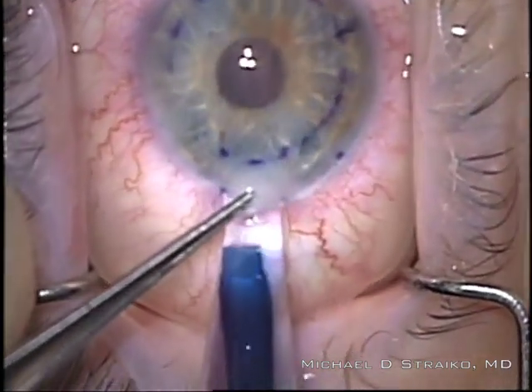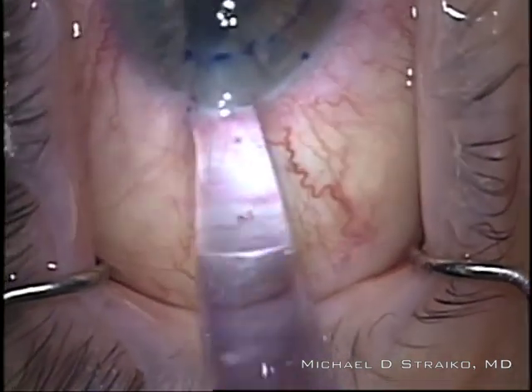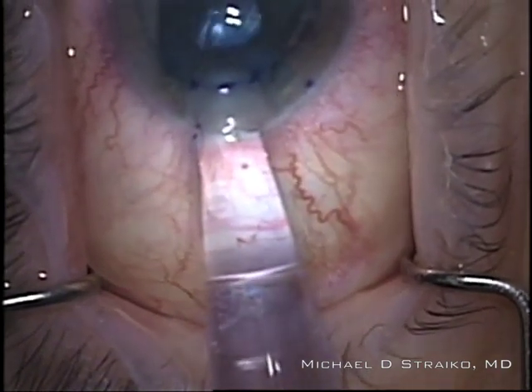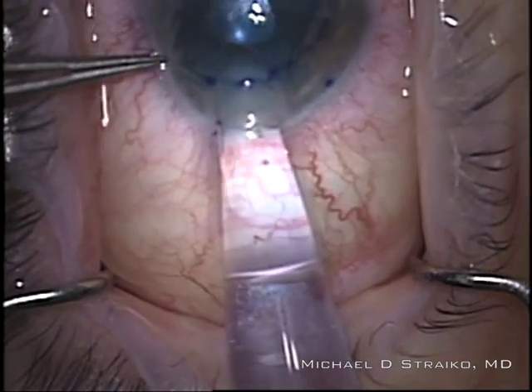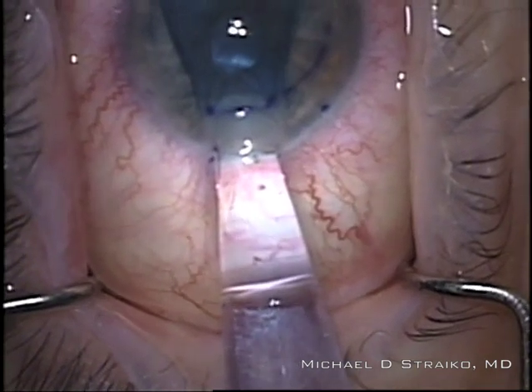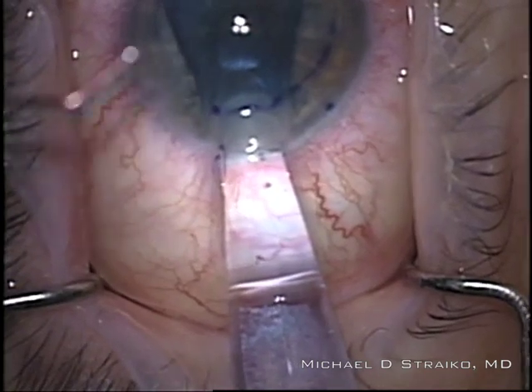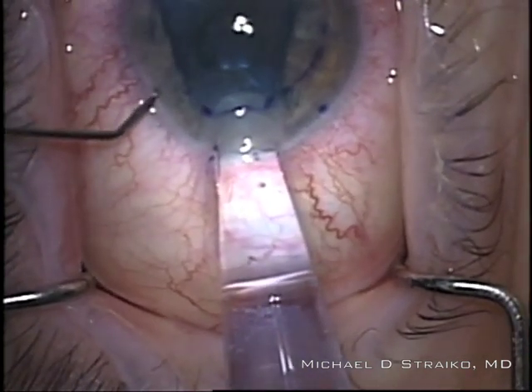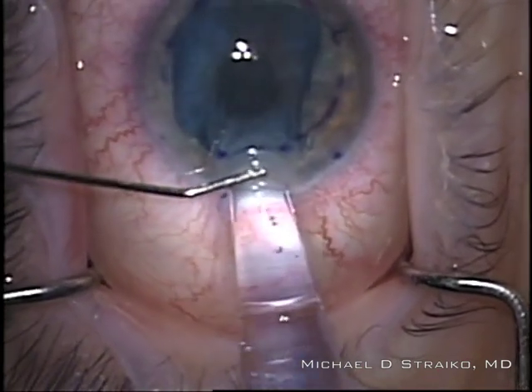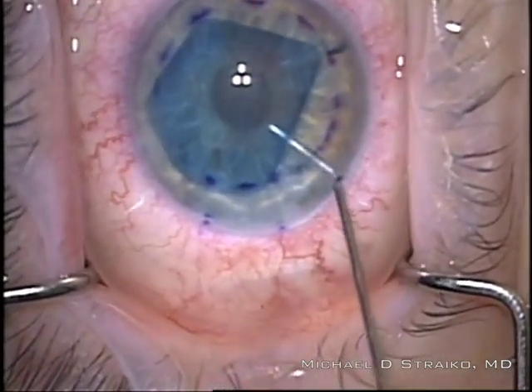Once it's loaded, I introduce it into the patient's eye — and since I already did a test fitting, I know the injector is going to fit. I make sure not to overpressurize the eye and release some fluid through the paracentesis. This just shows you that different grafts behave differently — this time the graft went in and it's a very, very flat graft, not scrolling tightly on itself at all. It just wants to open in position. The S-stamp is already showing me that it's right side up.